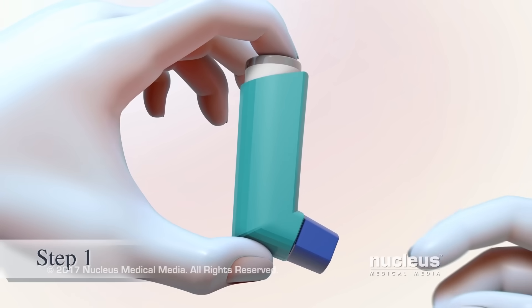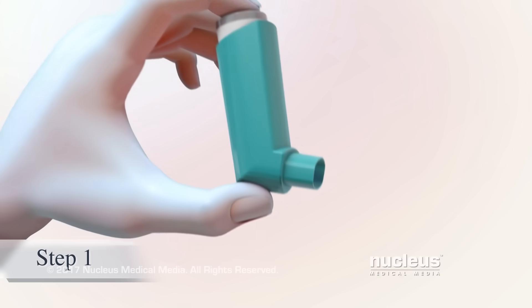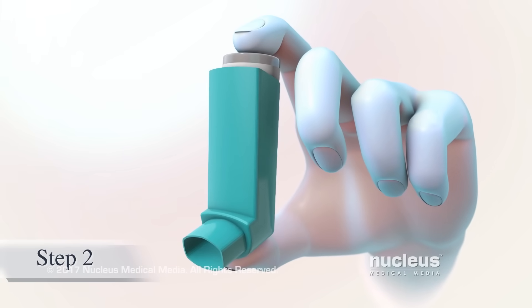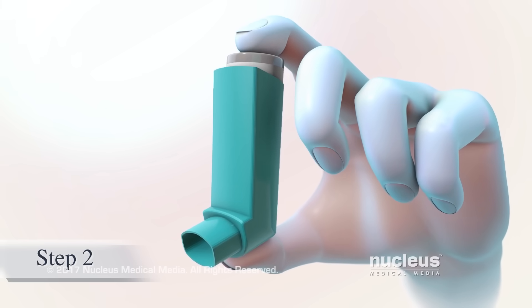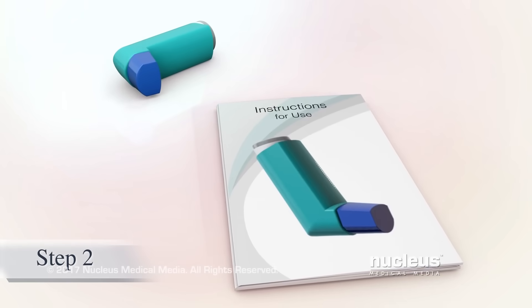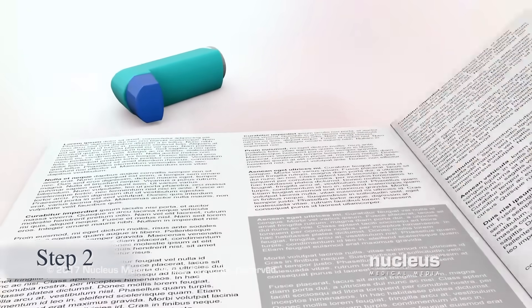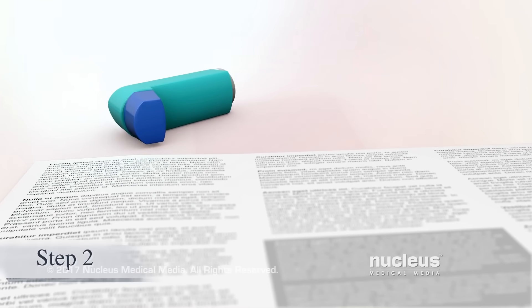Before using your metered dose inhaler, remove the mouthpiece cap and shake the inhaler. If this is the first time you are using your inhaler, or if you haven't used it in a while, you may need to prime it. Check the instructions for how and when to do this with your inhaler, as they can differ depending on the type of inhaler and medicine.